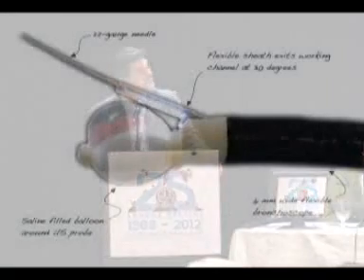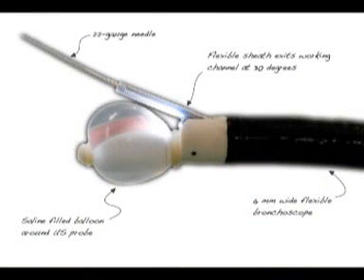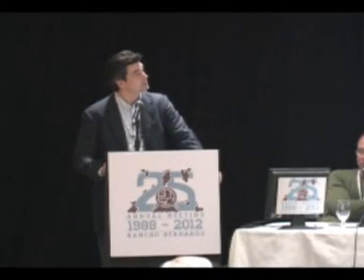That's great. So as you know, this is a 6 millimeter diameter scope that has a curvilinear ultrasound array at the bottom of it. And then there's this balloon that we place over the probe, fill it with saline to increase the acoustic coupling between the probe and the wall of the bronchus or trachea. And then there's a working port here that comes out at about a 30-degree angle. There's a sheath, which needs to come out first, and then there's a needle that comes out through that sheath. It's a 22-gauge needle, about 2 centimeters long. You can get 4 centimeters out of it, though.